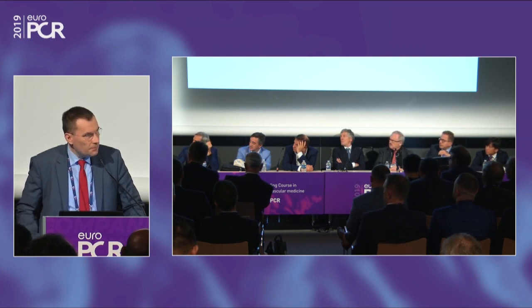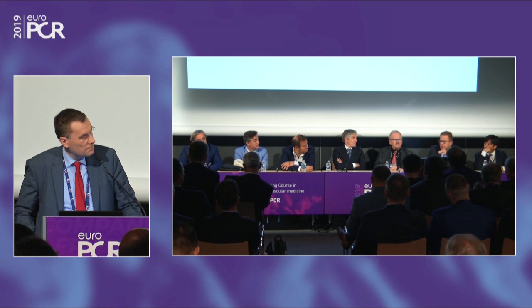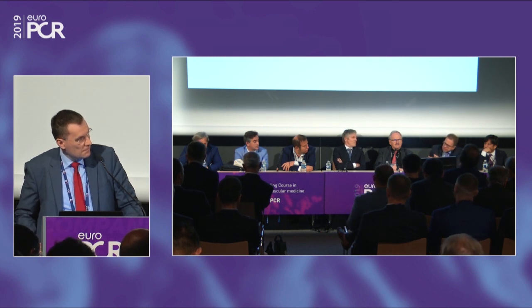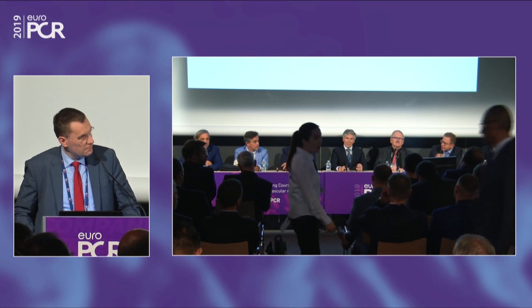So you suggest to utilize the smaller one at the beginning and the larger? I mean, it depends only on the angulation. Yes, for me. This is very important to know: you can enlarge at least by 1 millimeter both parts of the BiOSS stent. It was confirmed by Dr. Finet and is published right now. You can even proceed to 1.5 millimeters. So the differences between sizes you can optimize with the POT.